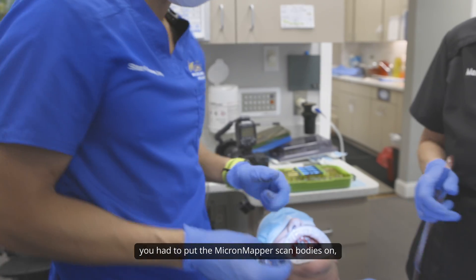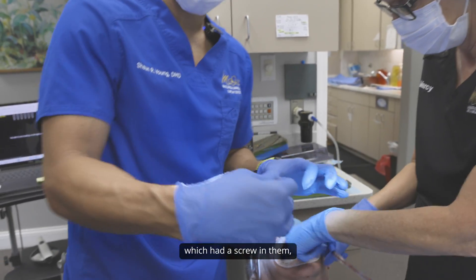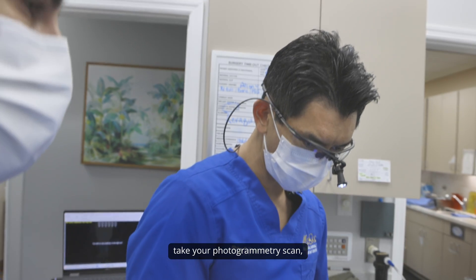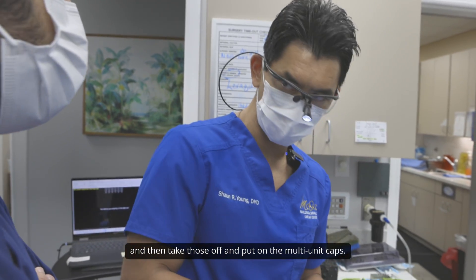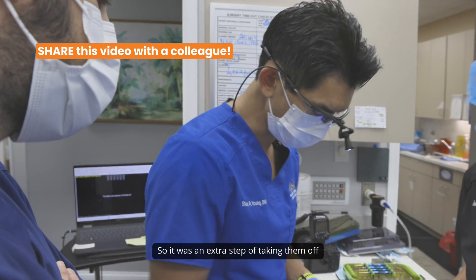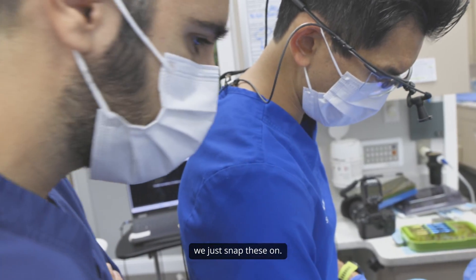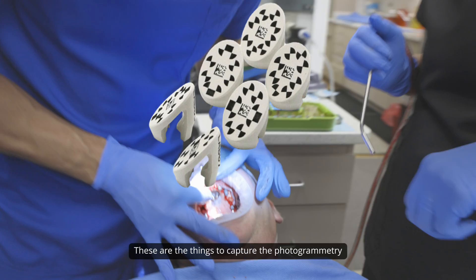With the previous scan bodies, you had to put the Micron Mapper scan bodies on — which had a screw in them — seat all of those, take your photogrammetry scan, and then take those off and put on the multi-unit caps. So it was an extra step of taking them off and putting a new set on. Now that these caps are on, we just snap these on. These are the components to capture the photogrammetry.